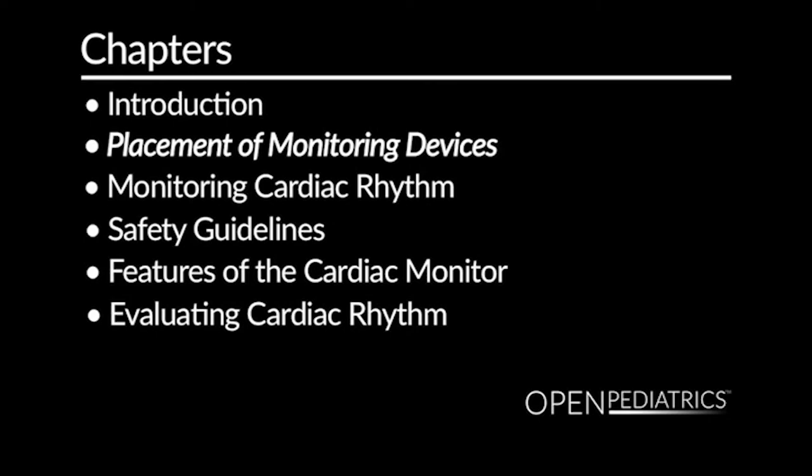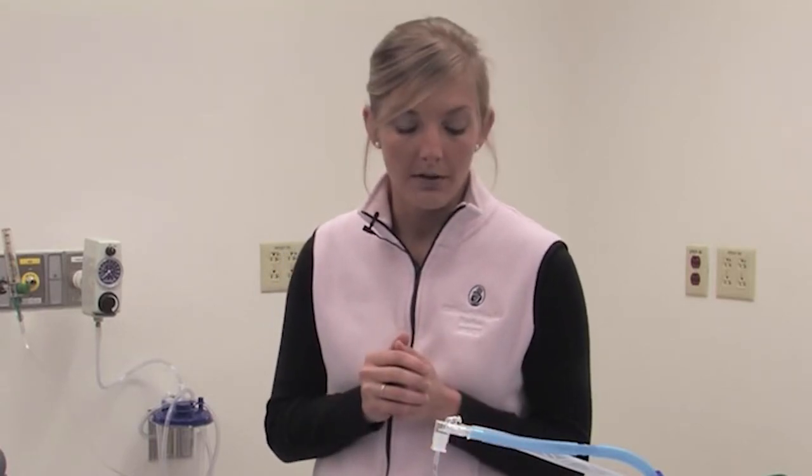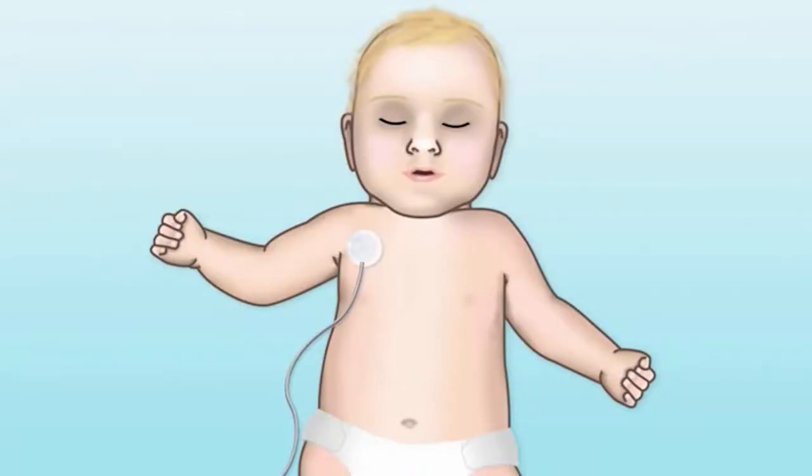Now we'll talk about how to effectively apply and use the cardiac monitor. Each monitor is a little different, but typically you'll have between three to five leads. On this patient, we have three leads available. There is a white lead placed on the right upper extremity or chest, a black lead on the left upper extremity or left chest region, and a grounding wire which should typically go on the left lower portion of the child's abdomen or chest. These work together to gain an electric picture of the child's heart rate and rhythm.